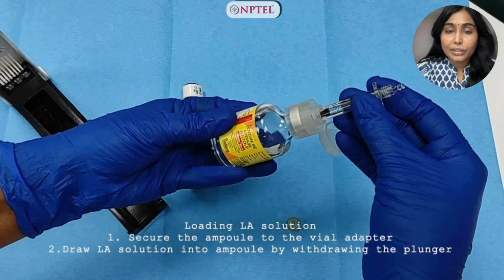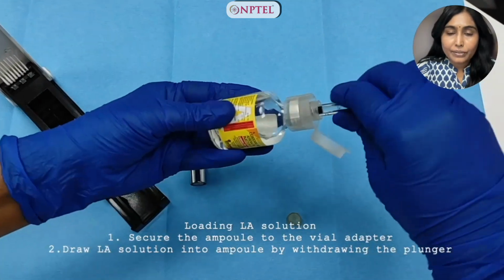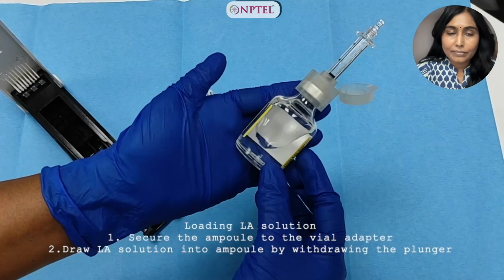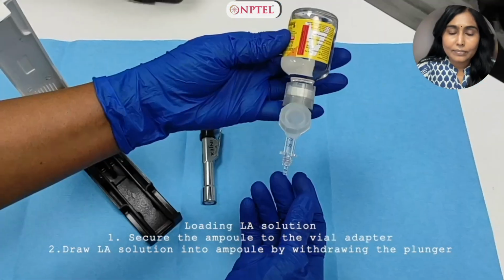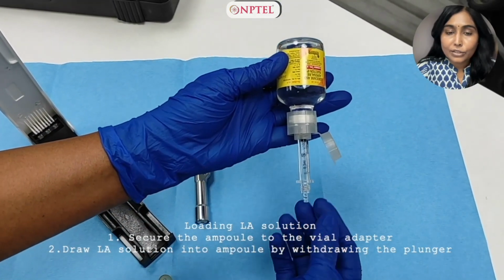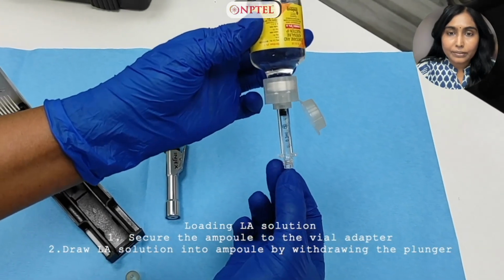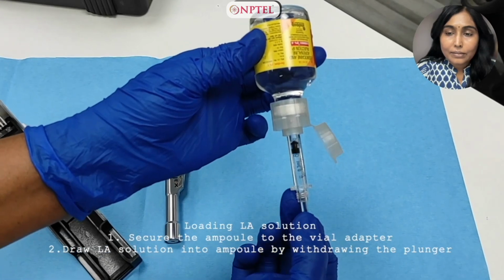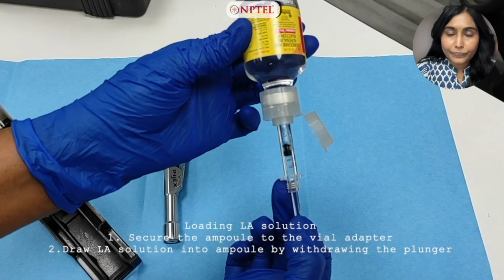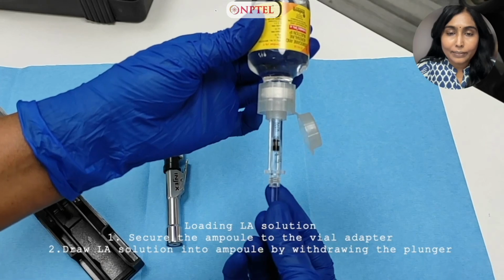Now we're going to start with loading the LA solution. I'm securing the ampule now to the vial adapter by firm twisting motion. Now I'm drawing local anesthetic solution into the ampule by withdrawing the plunger. You can see the local anesthetic solution entering the ampule. A volume of just 0.3 ml.